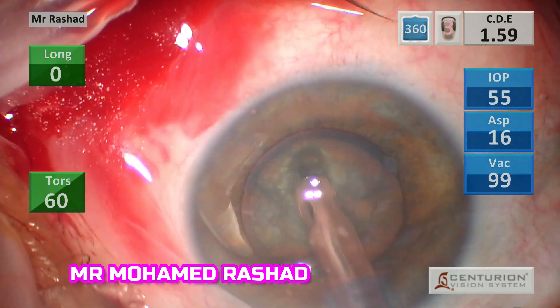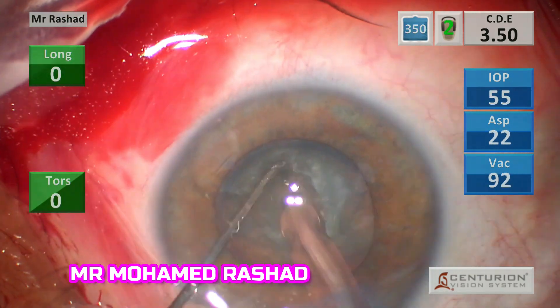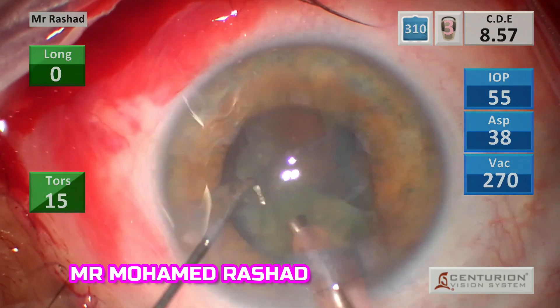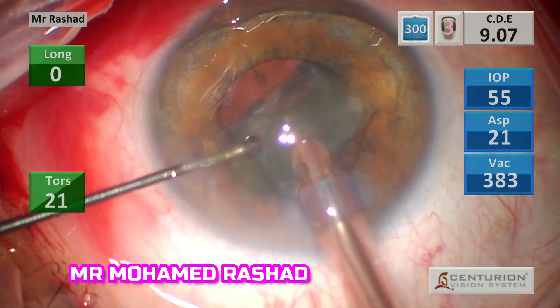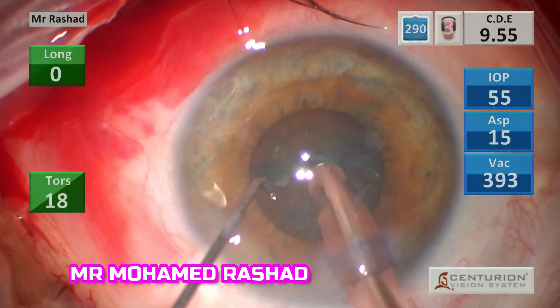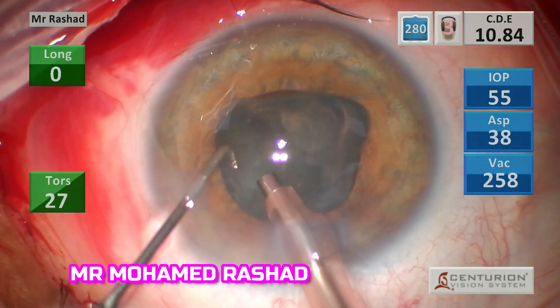Please remember the iris is your friend, so try to avoid any injury to the pupillary border during phacoemulsification. You can use any technique, but I prefer divide and conquer. Keep the phaco probe in the center to avoid any iris injury, and always keep the nucleus fragments in front of the phaco tip.